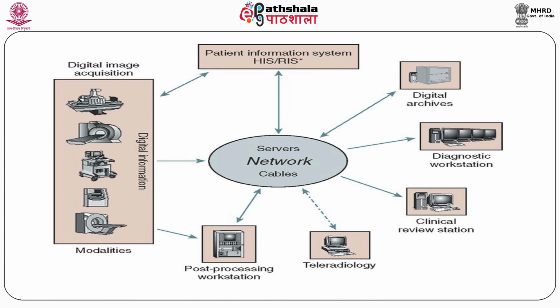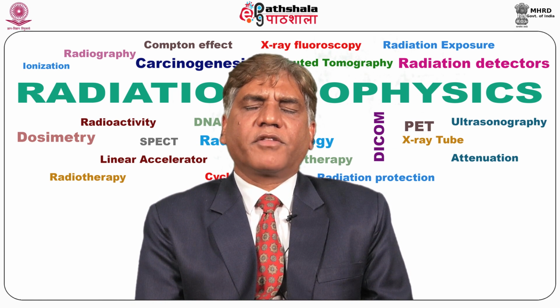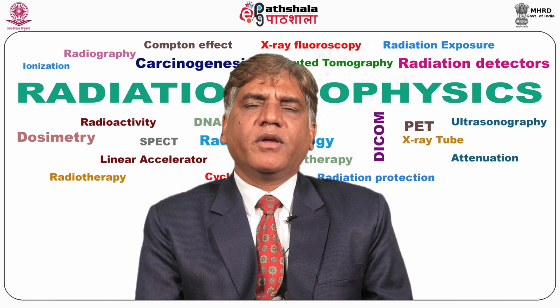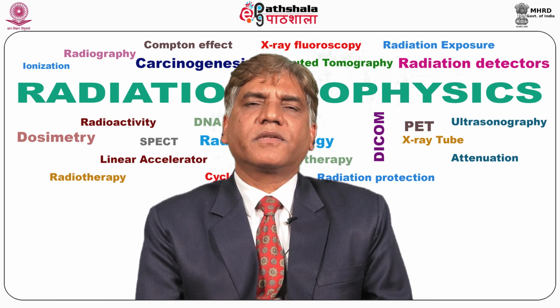The image can be transmitted to individuals in the department, outside the department, outside the world through Ethernet. So that is the advantage of PACS. PACS are an integral part, especially of the radiology department. We usually have in the radiology department the mini PACS.